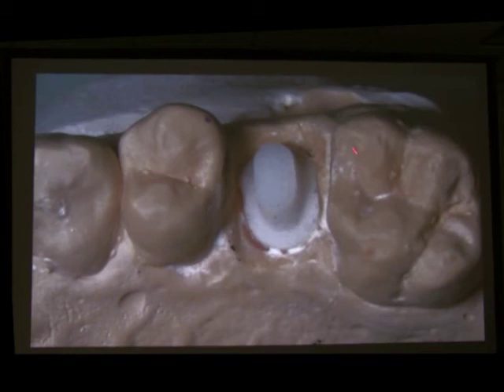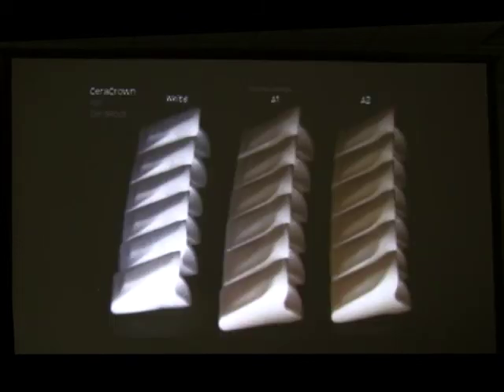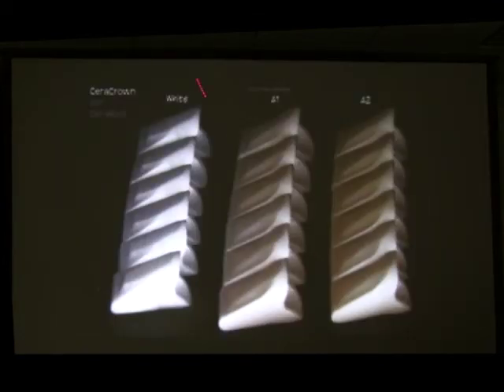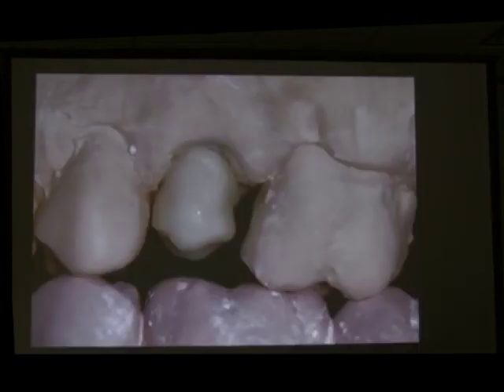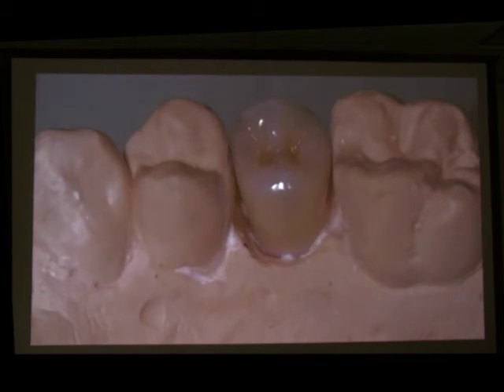The coping that was used here, you can re-sterilize it and use it again for another patient. But we decided to use this coping for this patient because it was almost an ideal situation. Again, we have different lab analogs and different implants, and most of the times, because we don't have to prep the implant, the shape of the coping has exactly the same shape as the implant. Different colors, occlusal space plenty, and this is the final crown made.